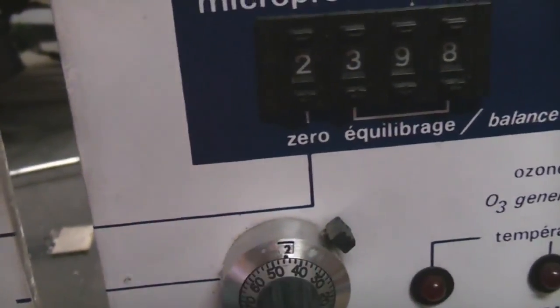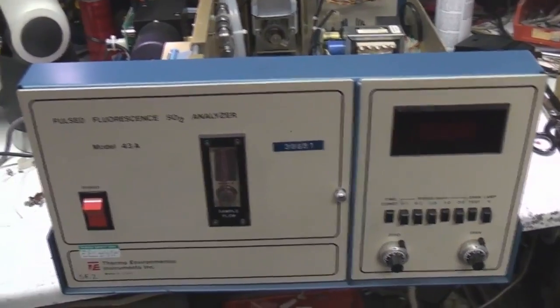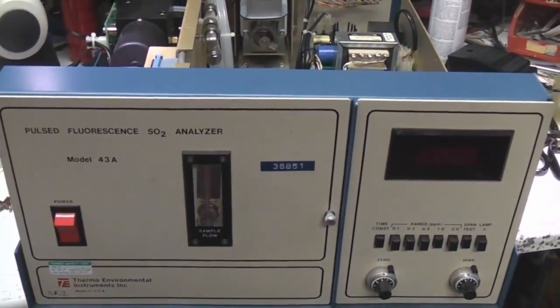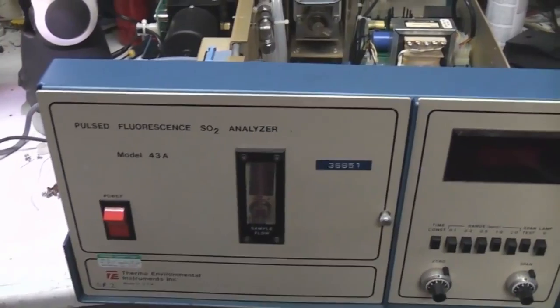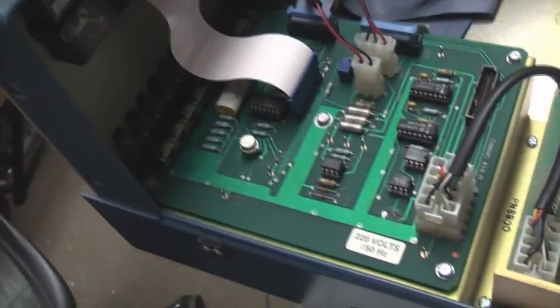Now onto this one - this is a pulsed fluorescence sulphur dioxide analyser. This works on a different principle: the previous one relied on a chemical reaction generating light, but this actually relies on fluorescence, or conversion of one wavelength to another. So this thing will have a light source in it as well as light detectors and probably some optical filters, so it's only detecting the wavelength of light from the fluorescence. This is actually electrically really simple - there's no processor at all in this; it's a completely analogue piece of kit. Just power supplies, some very simple analogue stuff, and a digital panel meter for the display.